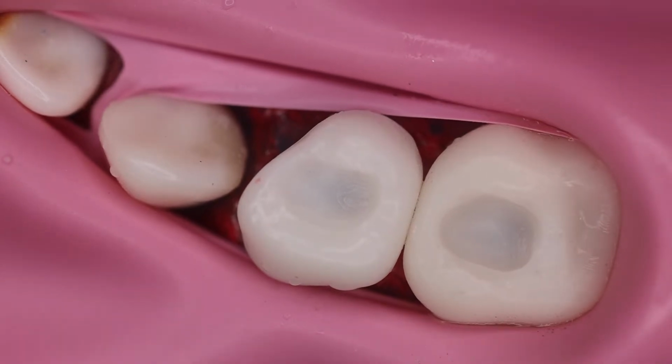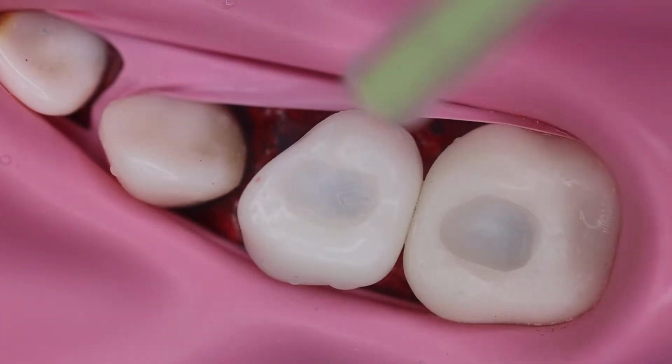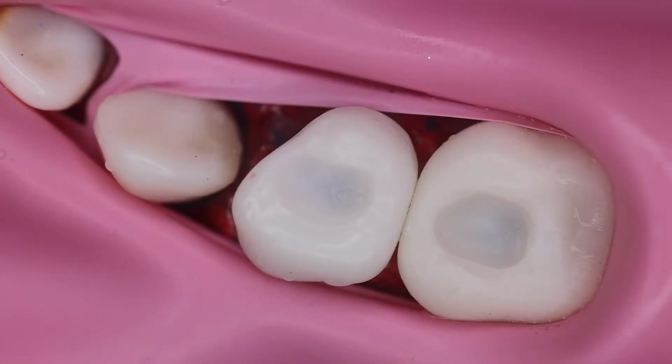The steps involved over here: once we have removed all the caries, we have dried the tooth. Now the next step is using the bonding agent.